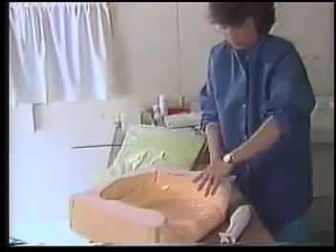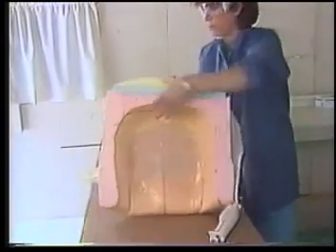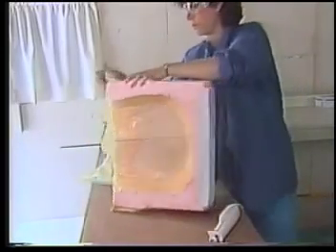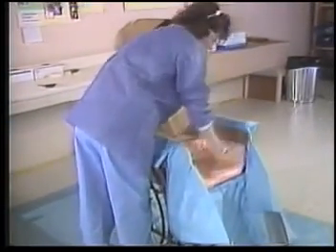After trimming, peel the plastic bag off the insert. If the foam is tacky, it needs to cure for a few more minutes. Neglecting to remove the bag will result in the insert becoming hard. Place the seat bottom back in the chair in preparation for molding a separate but matching seat back.